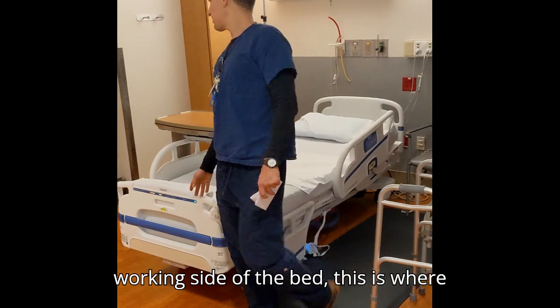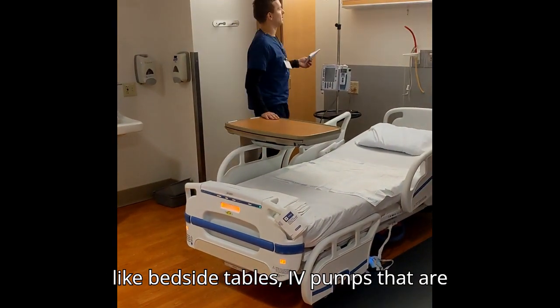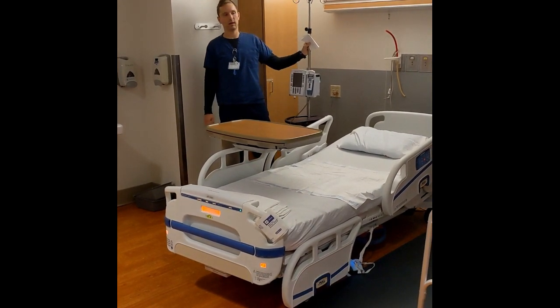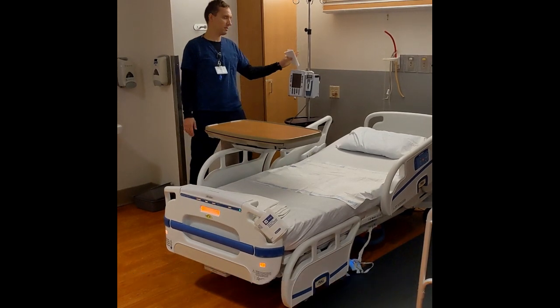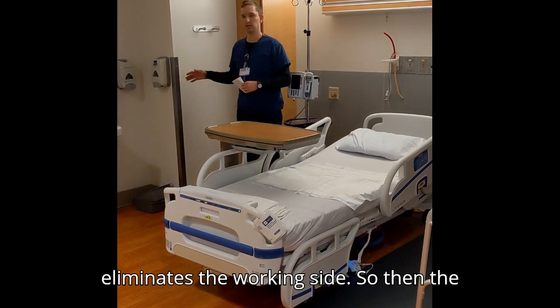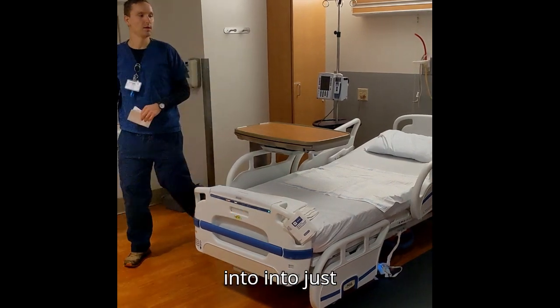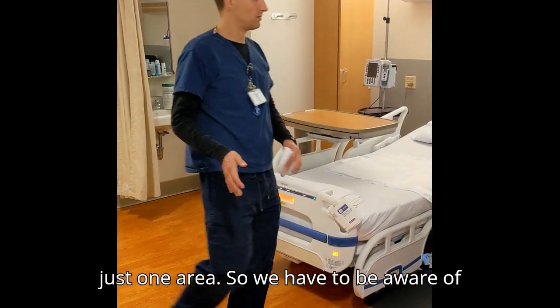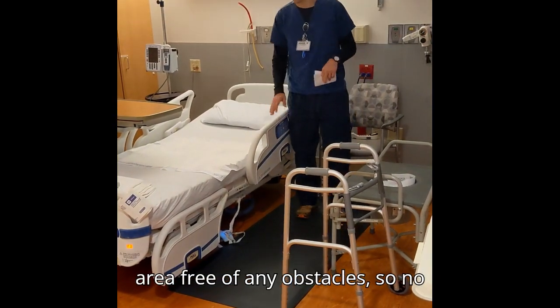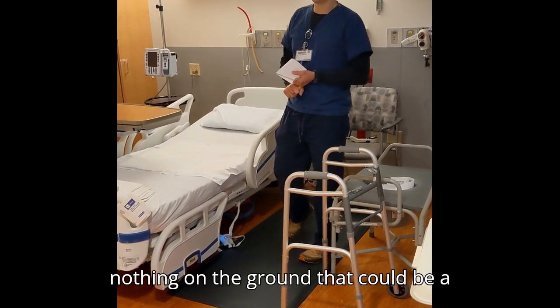And then on the working side of the bed, this is where we're going to have any equipment, like bedside tables, IV pumps that are running, any sort of medical nursing equipment. We're going to try to keep it over here. If the bed is against the wall, obviously that eliminates the working side, so then the two sides are kind of pushed together into just one area, so we have to be aware of that. We want to have the area free of any obstacles, so nothing on the ground that could be a trip hazard.